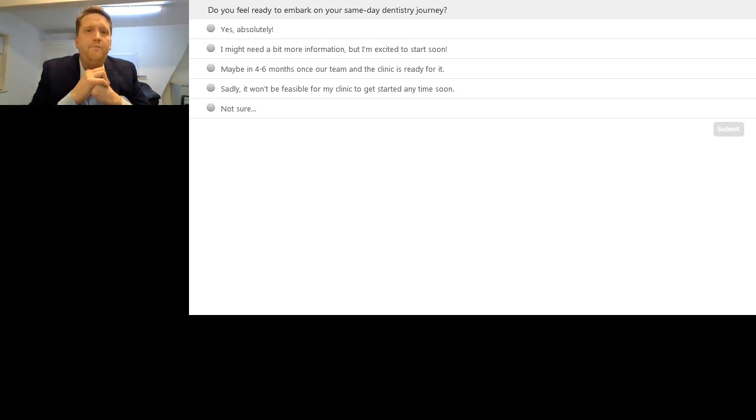That was great from the outset. My biggest changes probably were just slightly increasing my contact point and a slight increase of the occlusal contact as well. But really, I think within a couple of crowns, I got that, because I did say for the first few I did them on models. So I had one case where I'd made 2 crowns adjacent to each other, and when I fitted them onto the model, there was a slightly open contact. So I just added a bit of add-on ceramic to close that contact. I went over to my lab and begged them to help me, so the next time I did it, I knew I had to make that contact slightly higher.